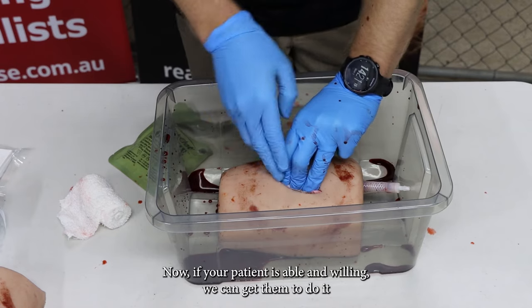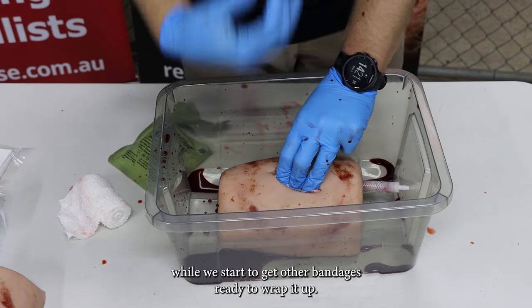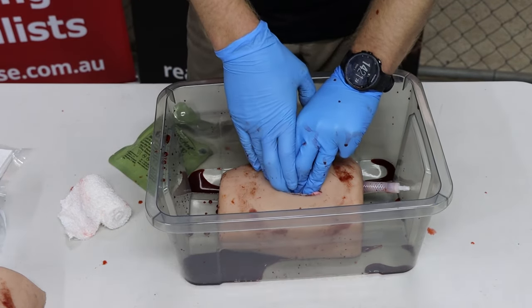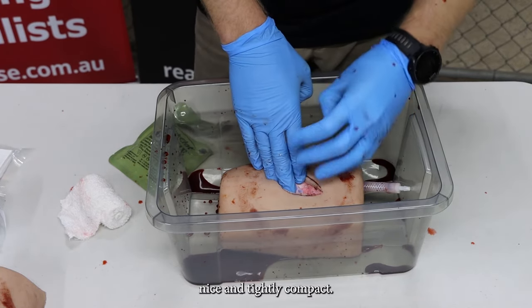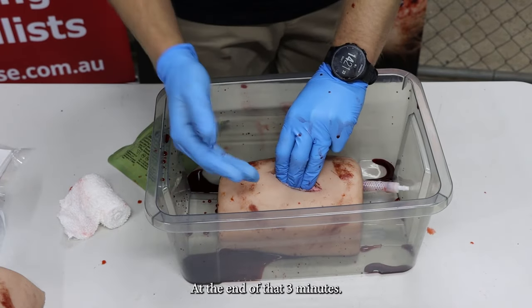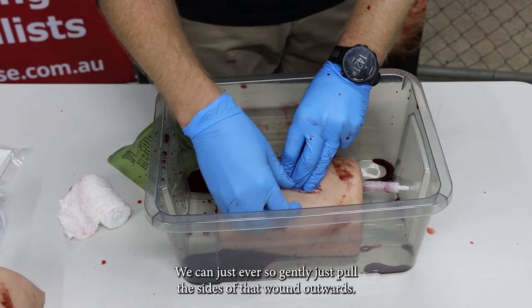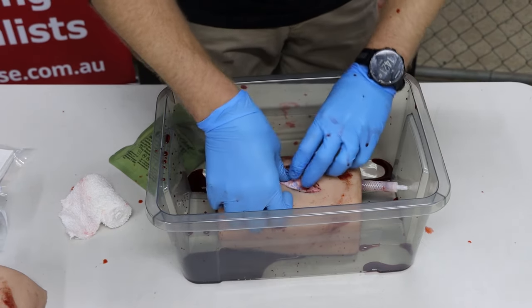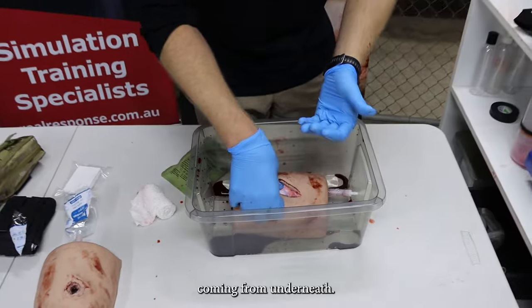Now if your patient is able and willing, we can get them to apply pressure while we start to get our other bandages ready to wrap it up. Because again, we can't just sit here with our fingers in the wound forever — we want to be able to move our patient while keeping everything nice and tightly compact. At the end of those three minutes, if you're happy and can't see any pooling coming from underneath, you can ever so gently pull the sides of that wound outwards, just making sure we haven't missed any bleeding coming from underneath.